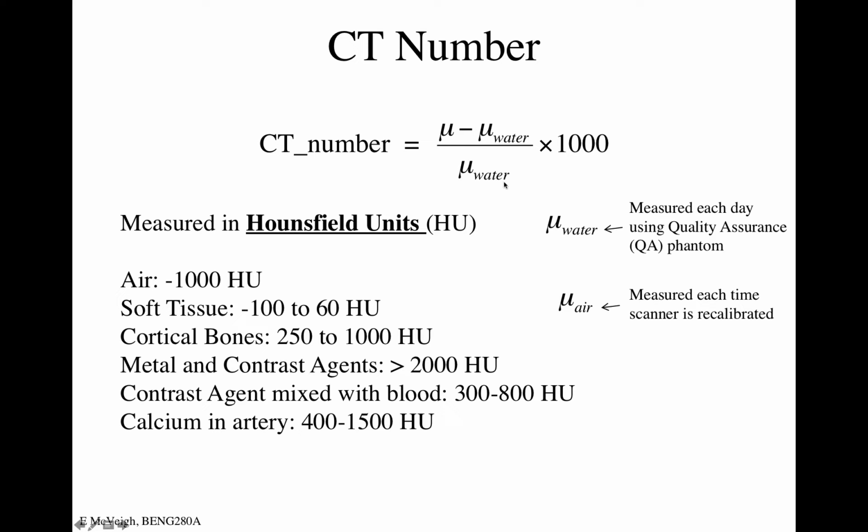You could just as well do this if you had a floating point picture, but in the early days of digital imagery, you needed values between minus 1,000 and 1,000. 8 bits would give you 256 levels, 9 bits gives you 512, 10 bits gives you 1,000.